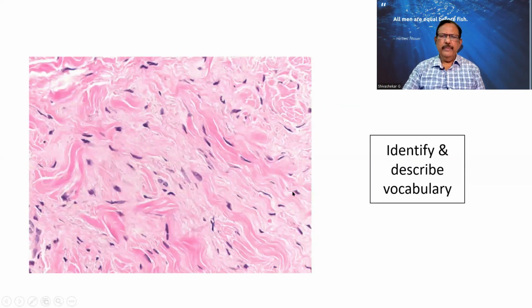Look at this, you people will be able to see. There is collagen over here. This can be a pale matrix. Look at this pale area, it is a matrix. This area is a cut surface of the collagen fibers. And these are all the nuclei of the fibroblasts. There is no necrosis, no inflammation. Fibrocollagenous connective tissue.